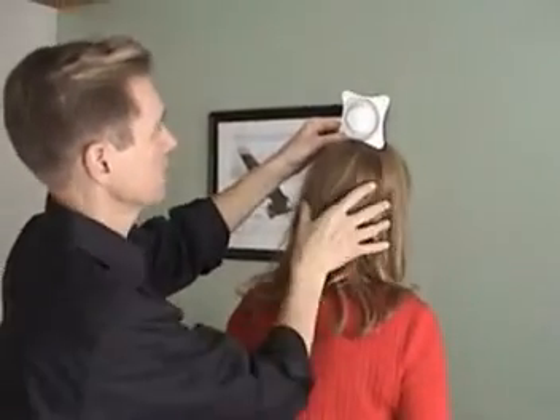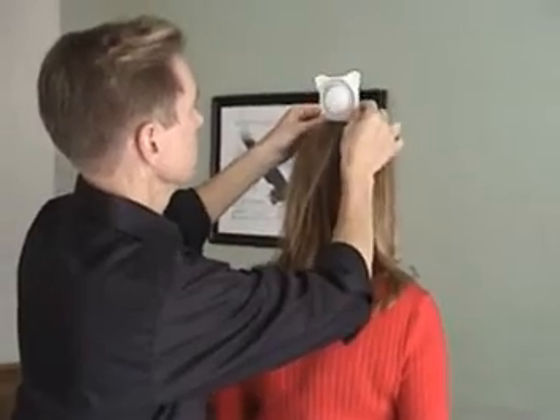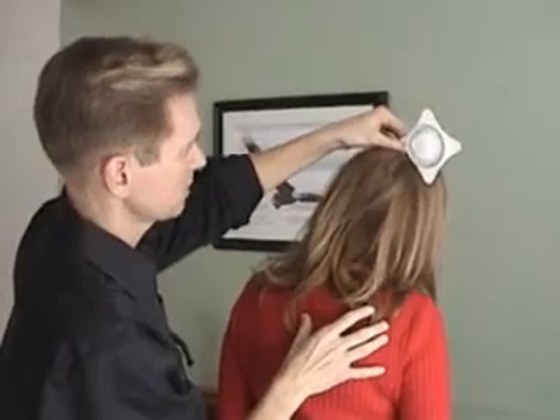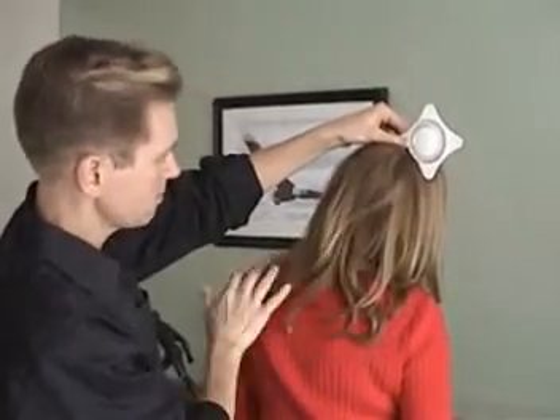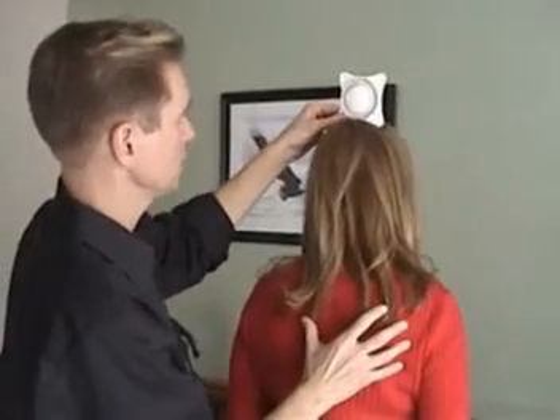To do lateral flexion, it's the same thing. When you laterally flex, the person will flex — in this case, to the right — follow the inclinometer over. She's at 50 degrees. Also keep an eye on their shoulders to keep them level, then go back to neutral again.